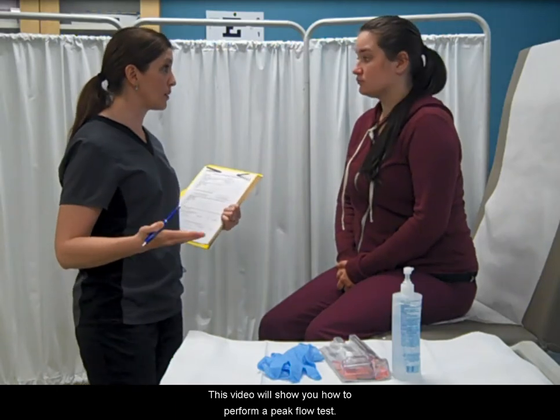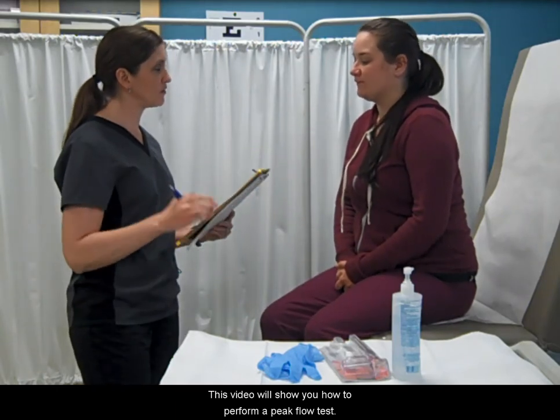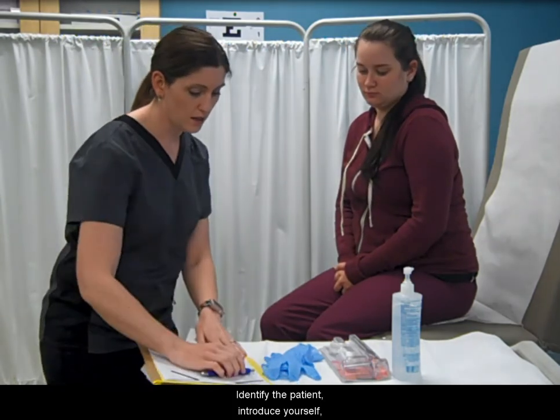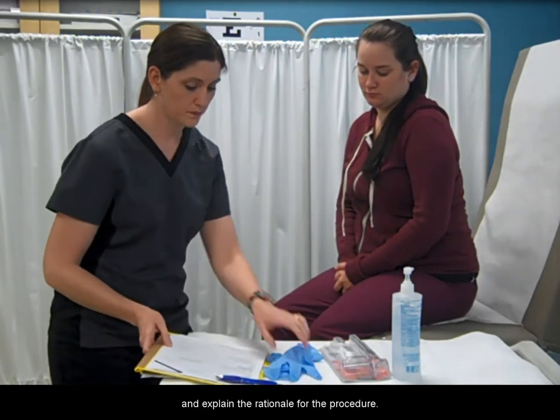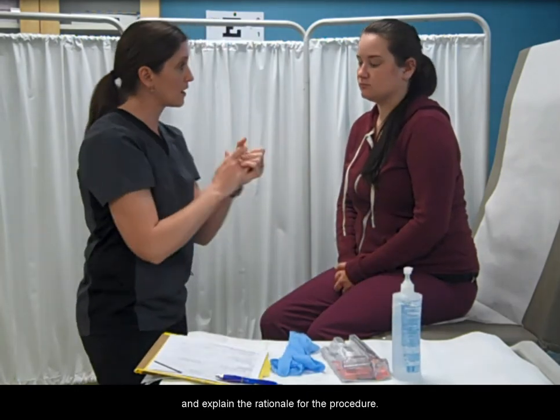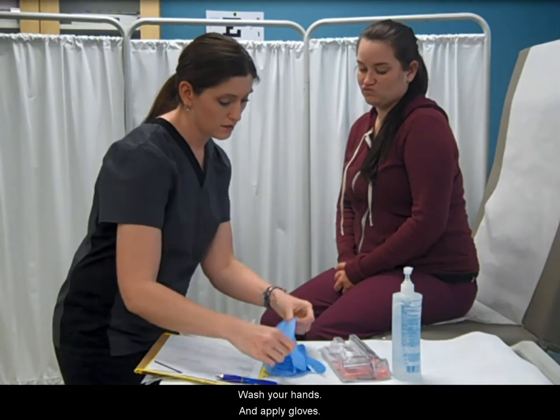This video will show you how to perform a peak flow test. Identify the patient, introduce yourself, and explain the rationale for the procedure. Wash your hands and apply gloves.